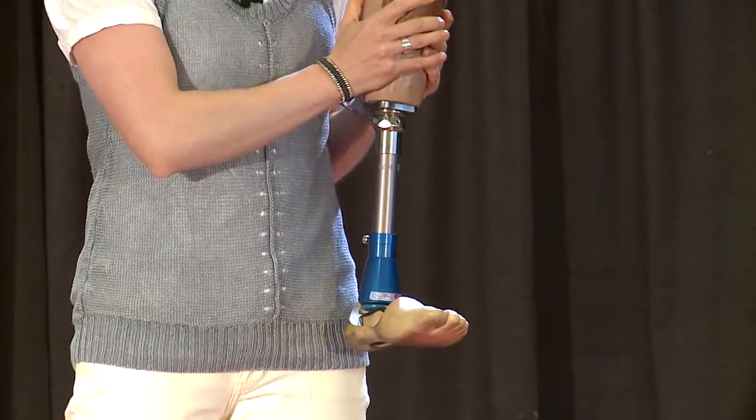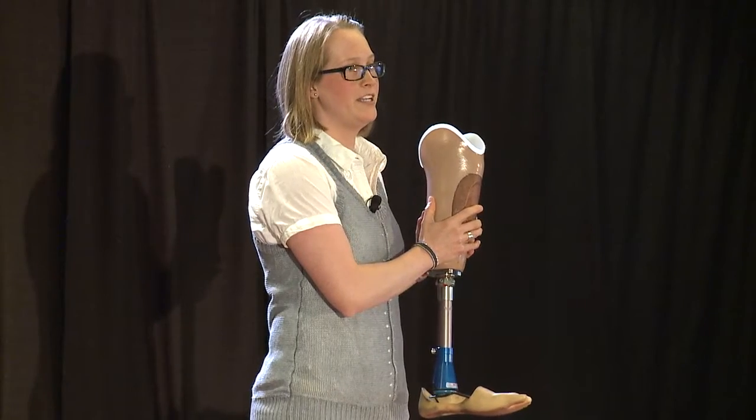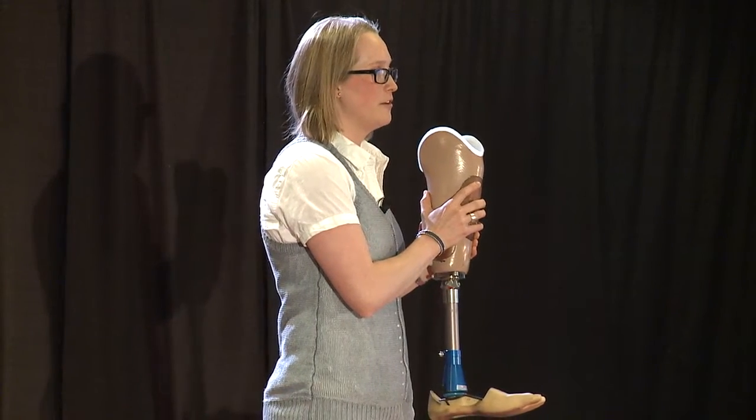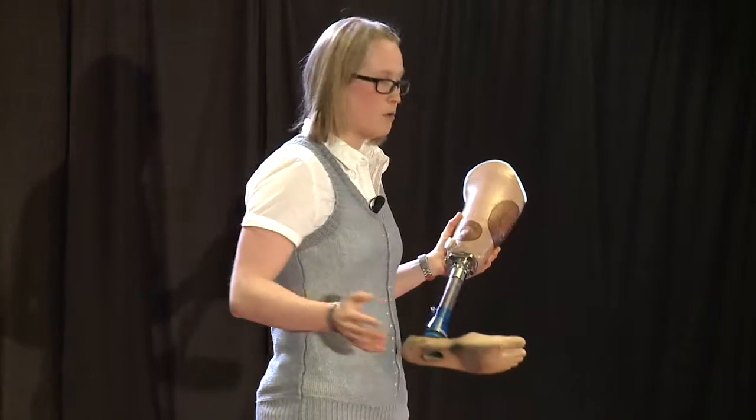Tonight, I'm going to be focusing on the prosthetic socket, because in a way, this is the most critical part of this whole device. If the socket doesn't fit, or if it doesn't work properly, this whole thing is useless.